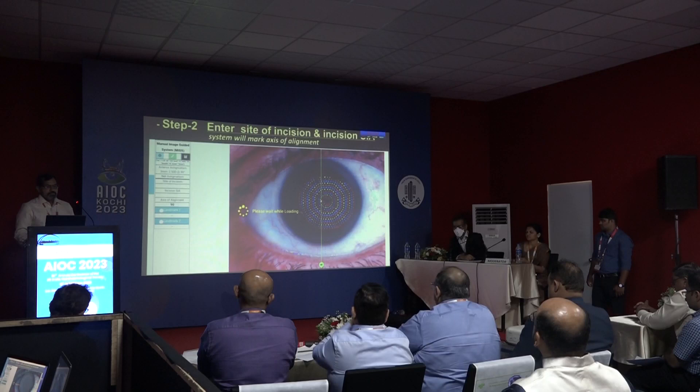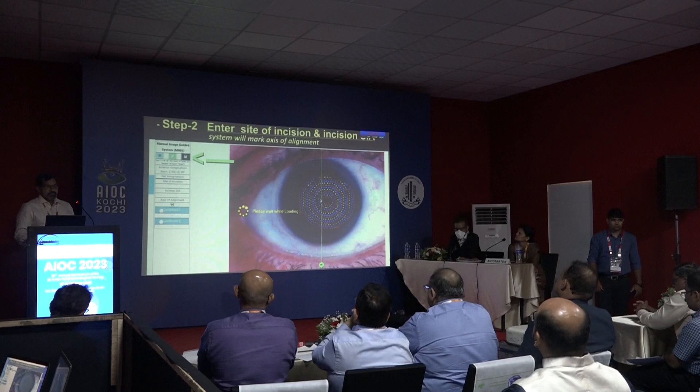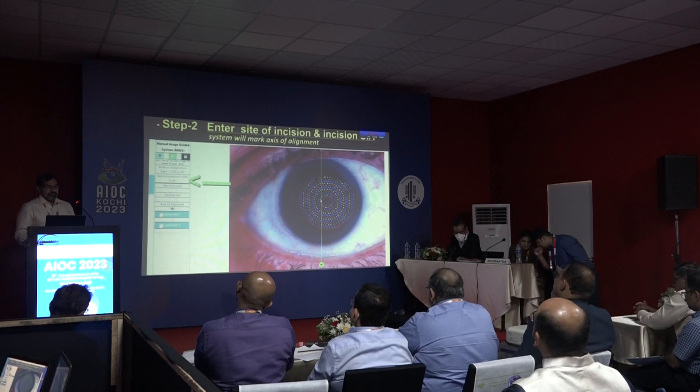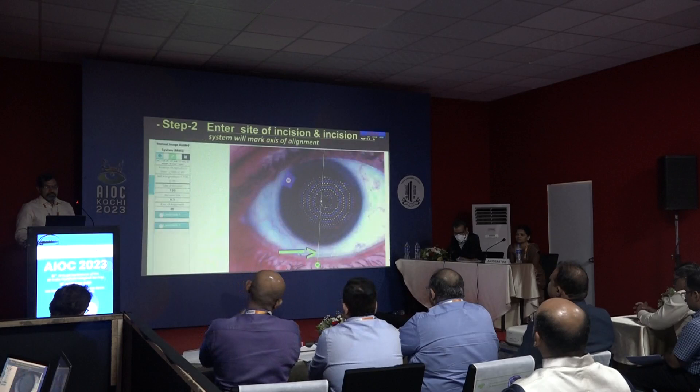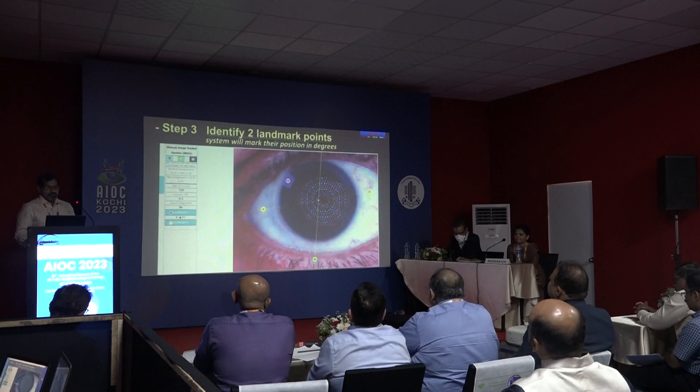Step 2: Marking of axis of alignment. The system has direct access to Barrett Universal 2 and Barrett Toric Calculator. Press the calculator icon and net astigmatism will be displayed. Now enter the site of incision and incision SIA and press the calculator icon again. This table displays net astigmatism as the site of incision is changed in a 40-degree range. The system has automatically marked the axis of alignment on the topography picture.